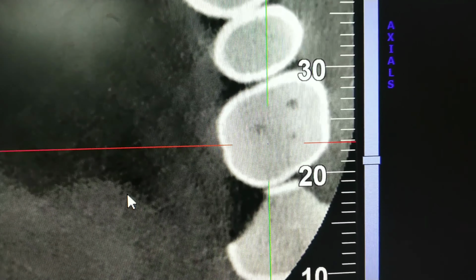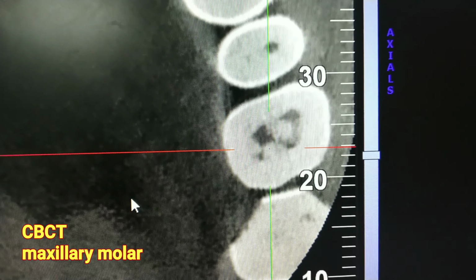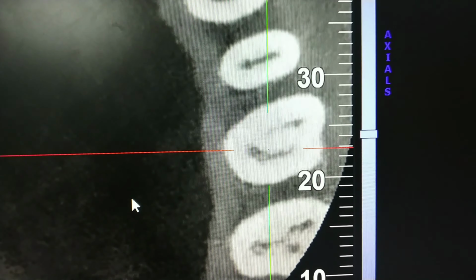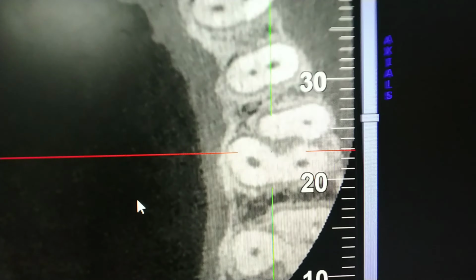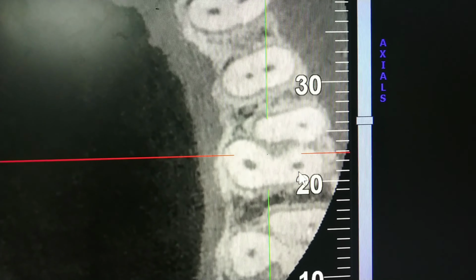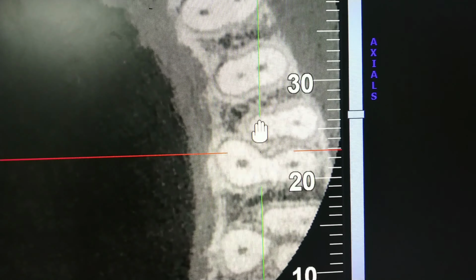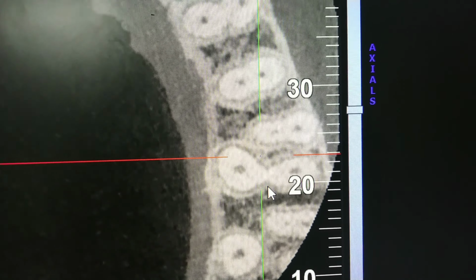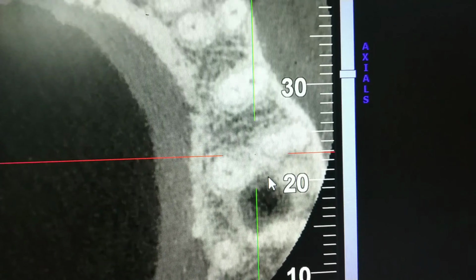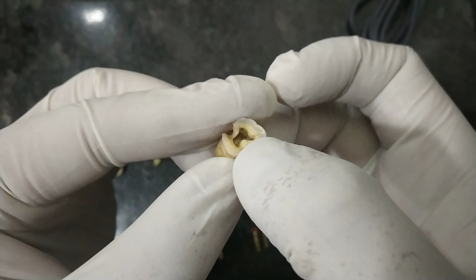Here we are looking at the CBCT of a maxillary molar, and this is the pulp chamber. As we go deeper inside, we can see there is an MB1 canal, MB2 canal, distobuccal canal and palatal canal. The MB2 canal is just palatal to the MB1 canal, and this is the maxillary sinus. Then there is the distobuccal canal.